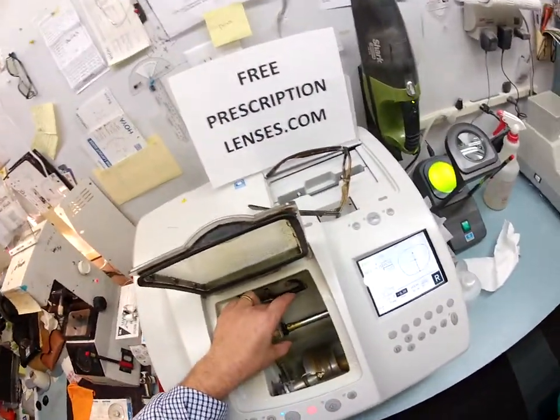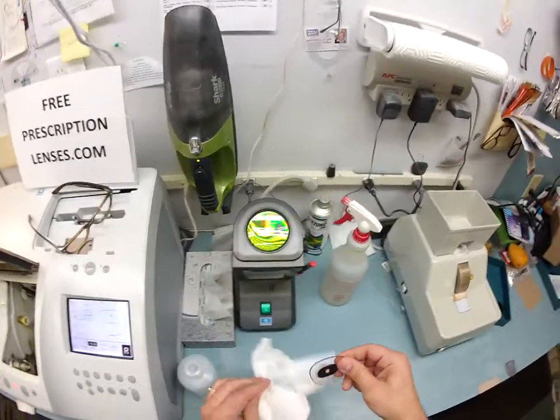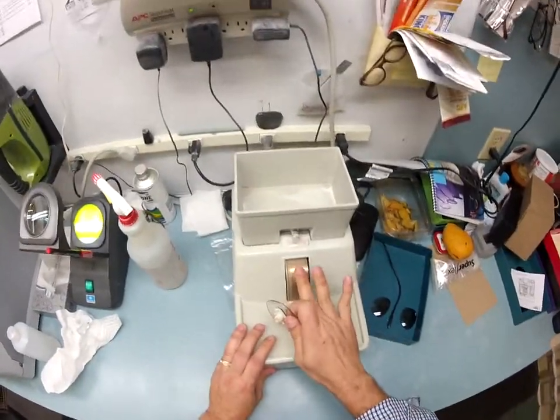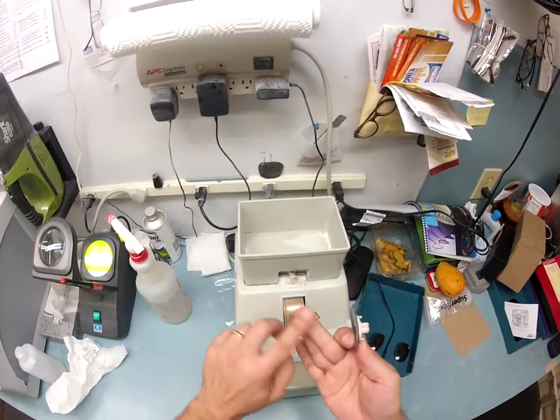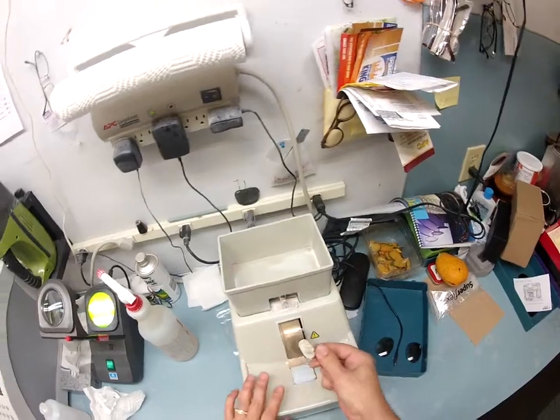Okay, so I'm going to take it out of the chuck. Thank you, Chuck. Excuse me, Charles. Okay, so I'm going to dry the lens off. I'm going to go over to my hand stone and try and remove. Now, this is completely flat. I can put my finger against it while it's running, and it does get warm, but I'm going to go all the way around. And this is known as the safety bevel.